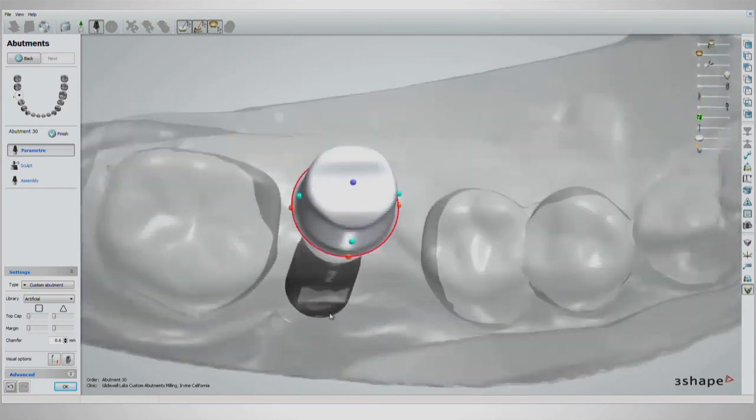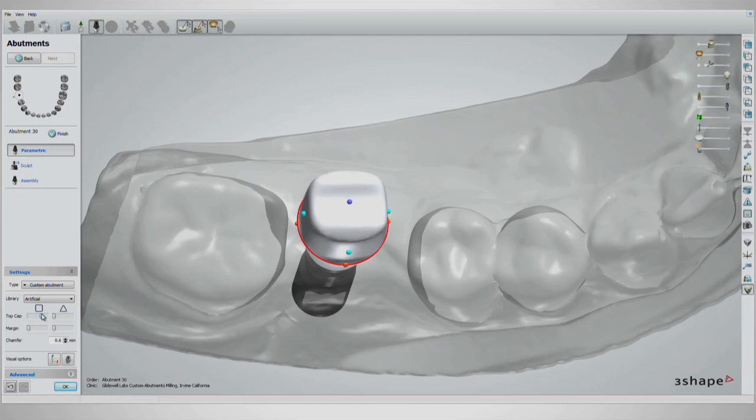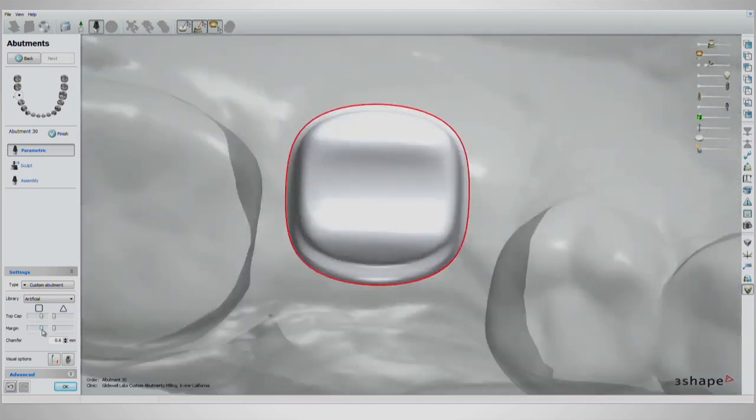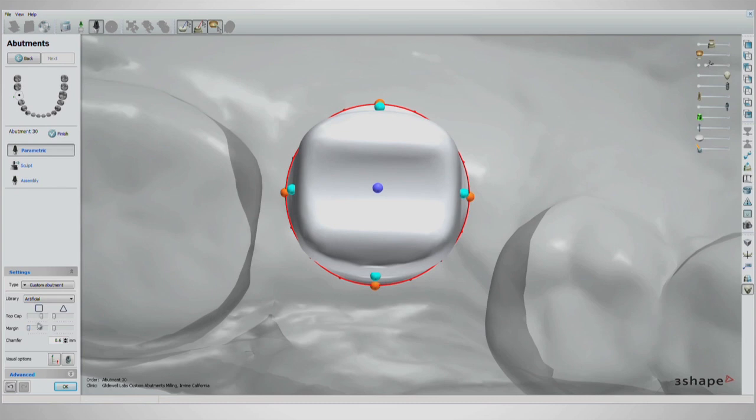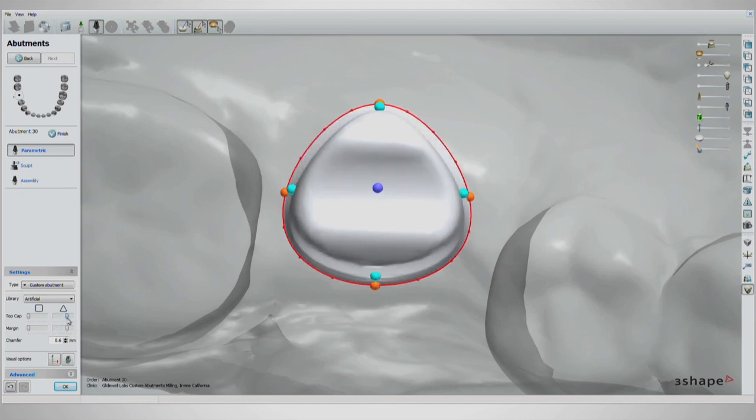Since this case is a first molar, we're looking for a nice square shape. This can be achieved by moving the square top cap and margin sliders to the right. The triangular top cap and margin sliders should be used on anterior designs. A mix of the triangular and square sliders can yield a good base design for a premolar.